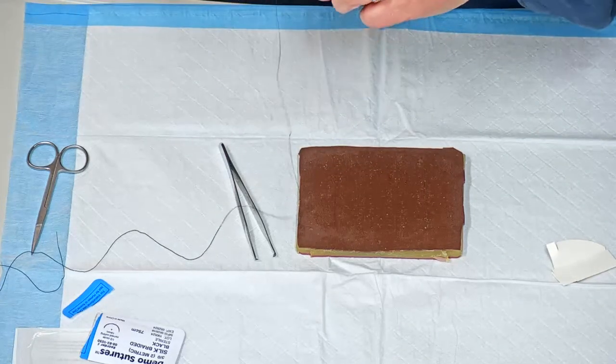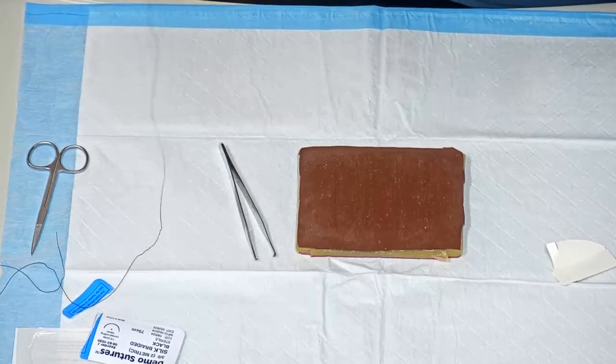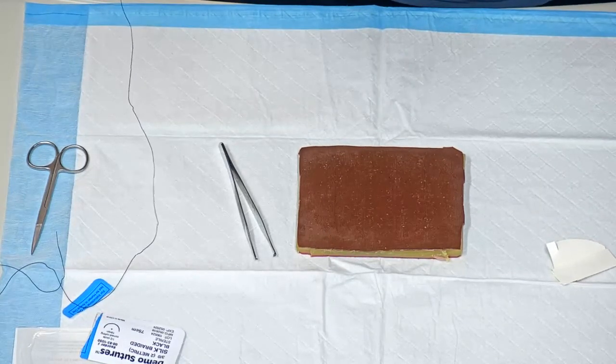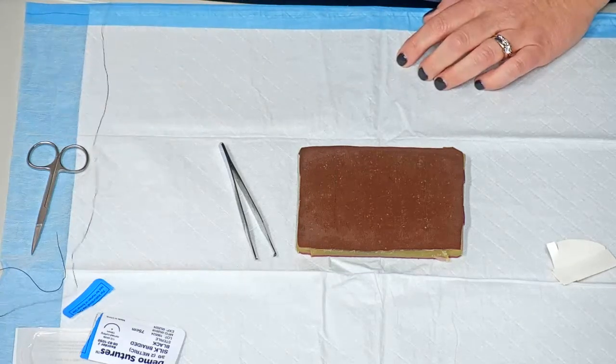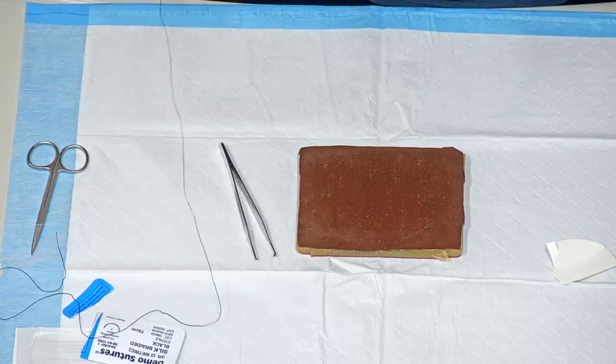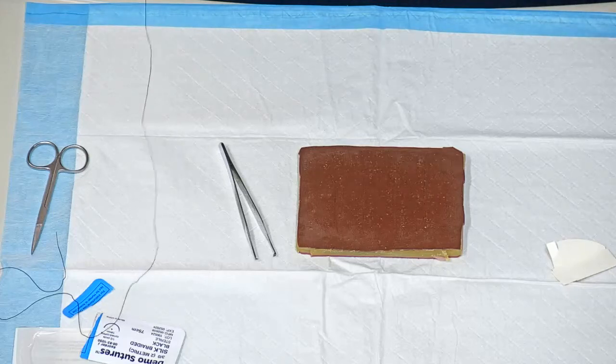As you load your needle, I'm going to do that again for you, you'll kind of go 2/3 back, and I'm right-handed, so when I look at it, it's going to look like a rainbow going off to my right.